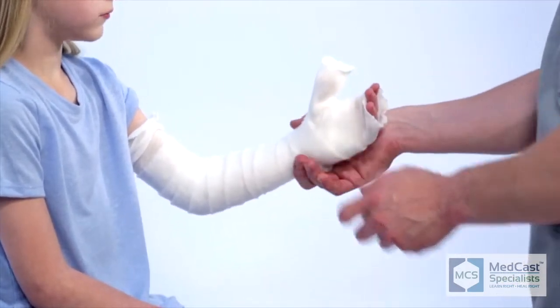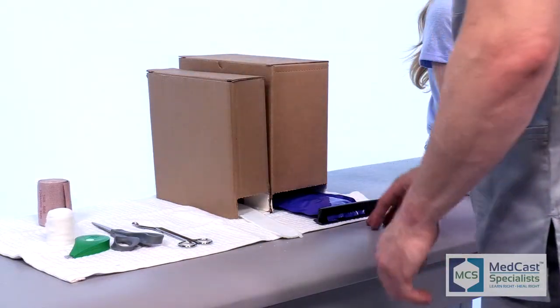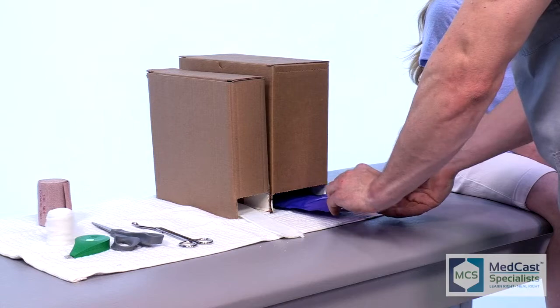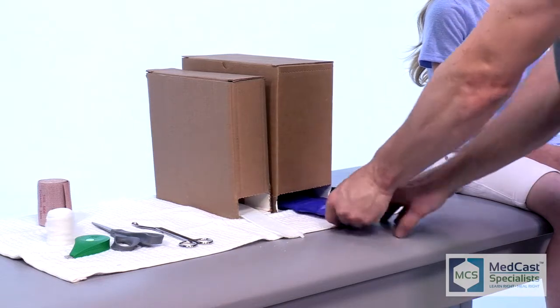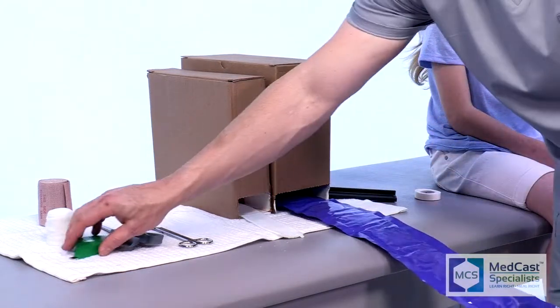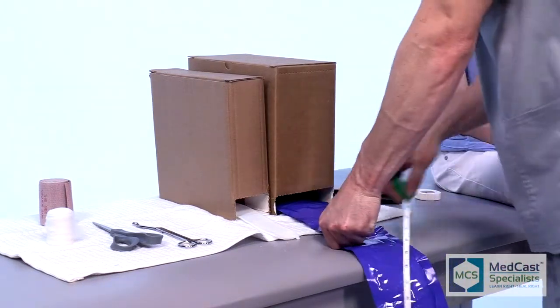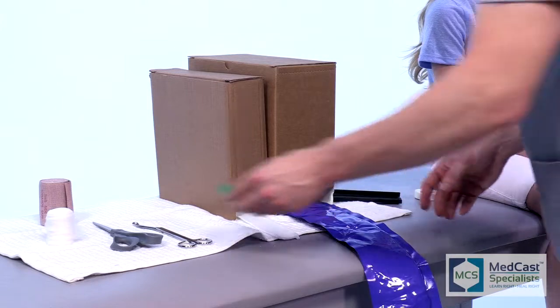Now pulling out the fiberglass — it's always good to measure it. Oftentimes we eyeball it and we're usually spot on, but there's nothing more frustrating than cutting it too short. You always want to make sure you're a little bit long. You can always trim it back, but once it's short you can't make it longer.